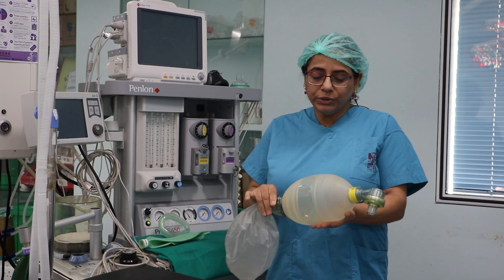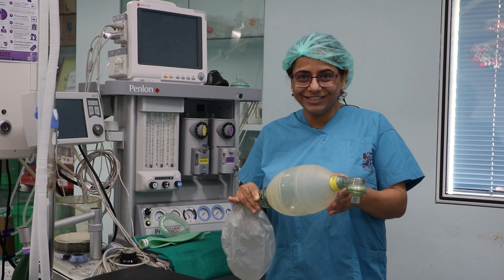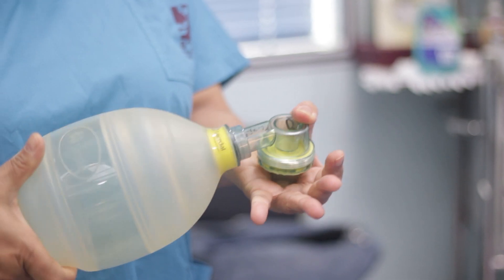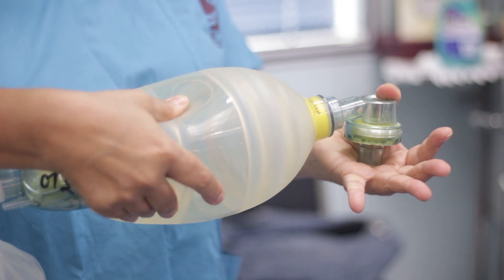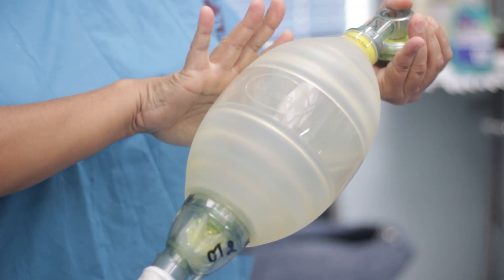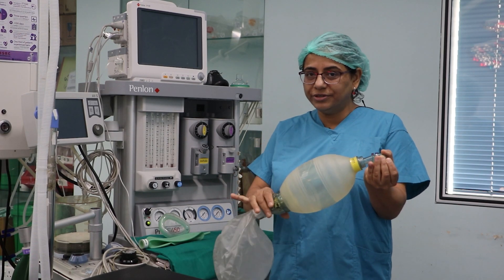Then when you squeeze this bag, it should release on its own — so this is self-inflating, and this is happening. Now when I obstruct the patient end and try to squeeze it, I feel resistance. That means this valve is functioning, and oxygen and air is not going out from the bag in the reverse direction.